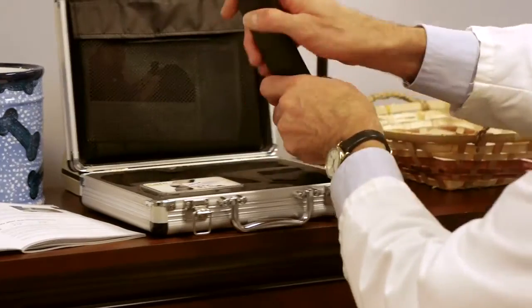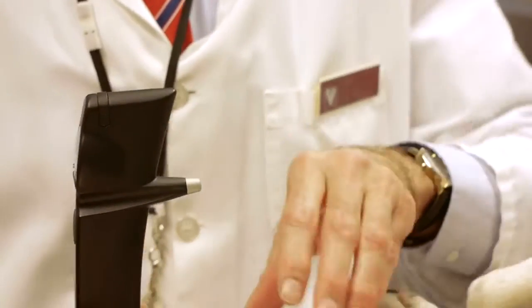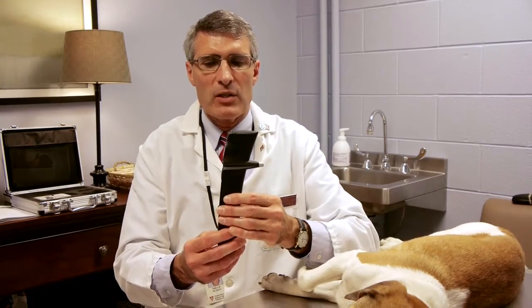This is an instrument that is used to measure intraocular pressure in animals. This is the Tonovet rebound tonometer. This instrument is made in Finland by iCare and it is distributed by Jorvet here in the United States. As you can see, it has numerous buttons.